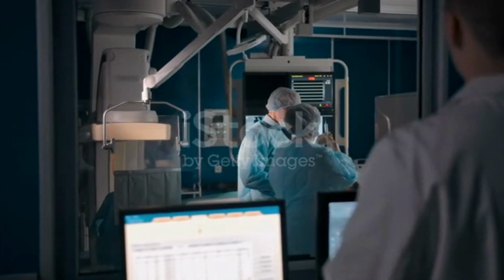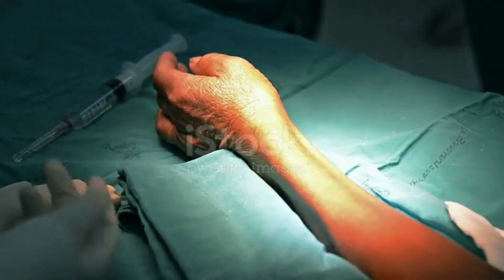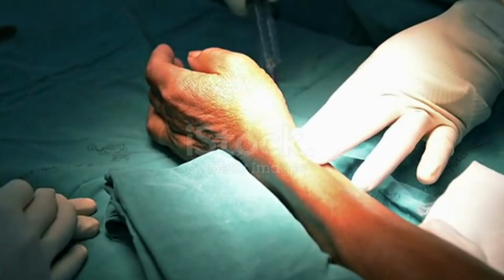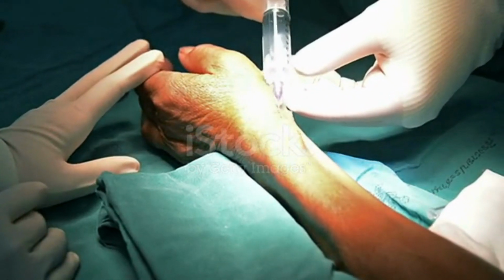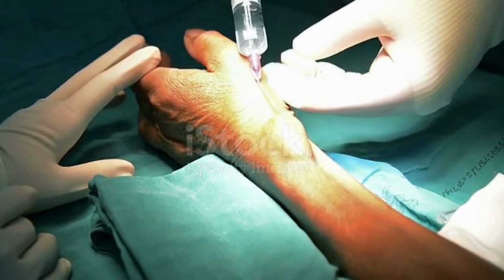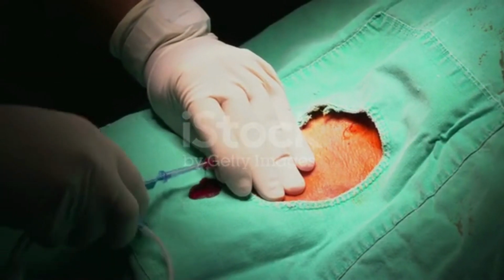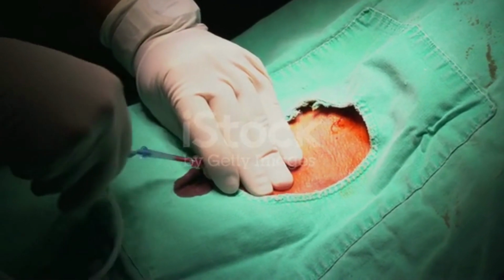Normally you are admitted to hospital a few hours before the procedure starts. You will be taken to a special cardiac catheterization laboratory or operating room, and will be asked to lie on a narrow table. The medical team will insert an intravenous line, and may give you a sedative to help you relax. The team will inject a local anesthetic into your groin so it is numb before making a small cut. They will then insert a catheter, a long thin tube, into an artery in your groin. Occasionally, the arm is used instead of the groin.